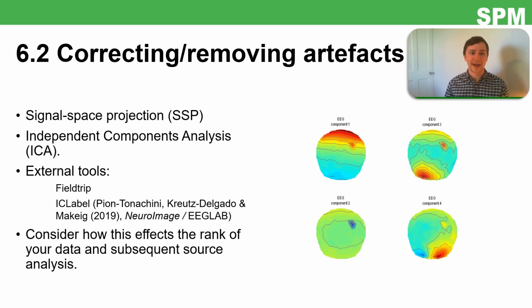You get some pan artifactual set of trials almost, and you use these to build a couple of subspaces orthogonal to each other, and then you remove the one which contains the artifactual data. Yeah, and that works really well.